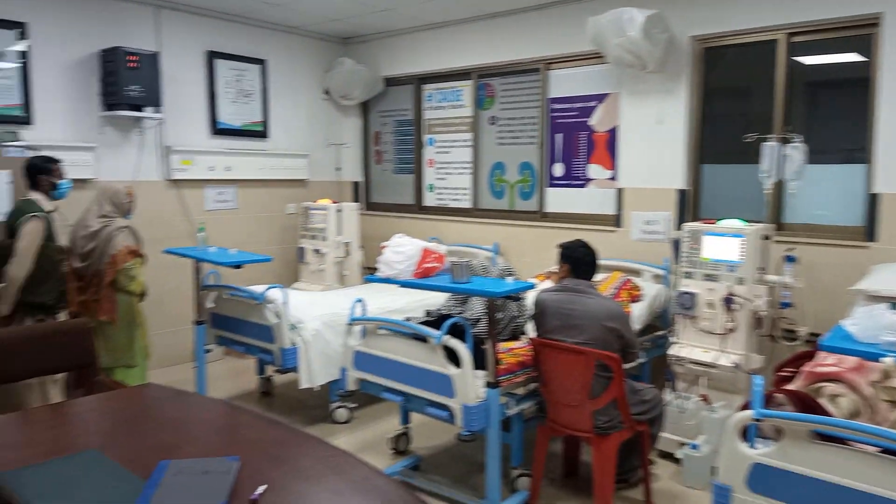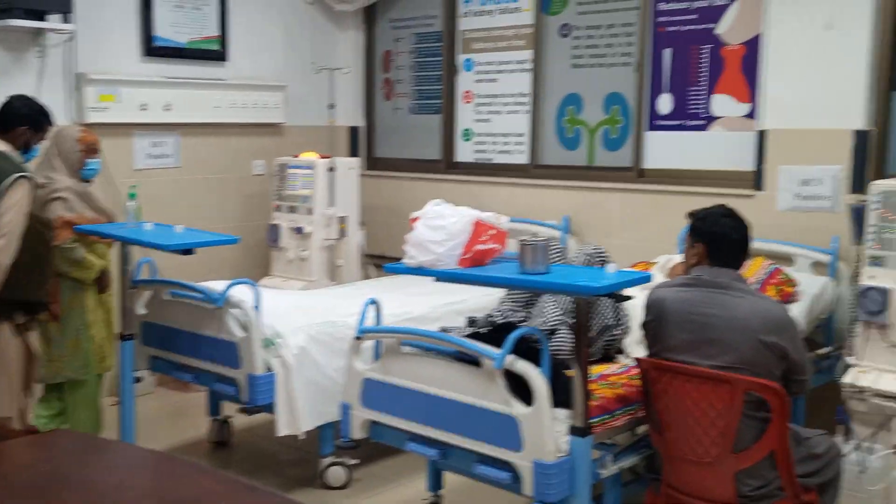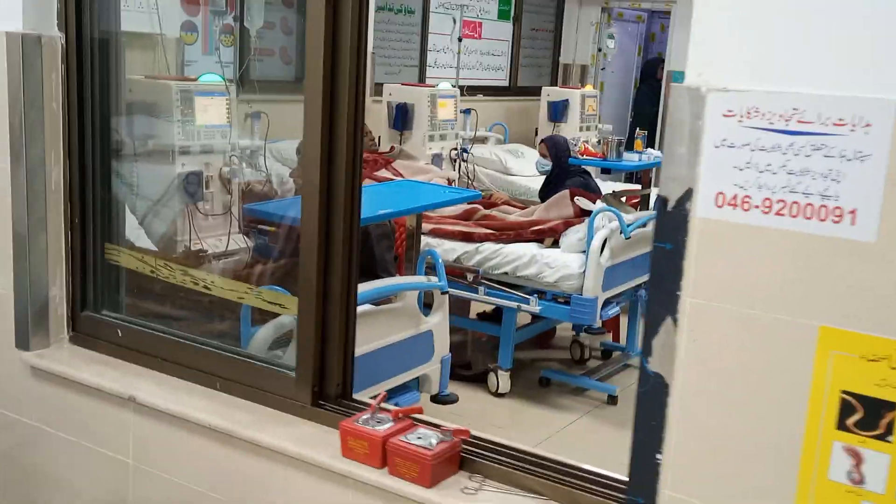Dialysis patients are divided into two types: number one is Hepatitis C virus positive, and number two is Hepatitis C virus negative. The positive patients are on one side of the room and the negative patients are on the other side.